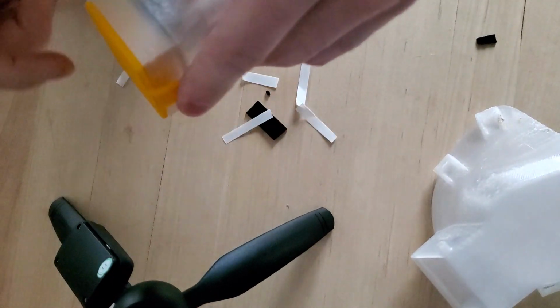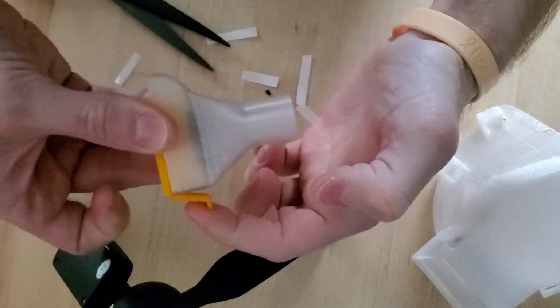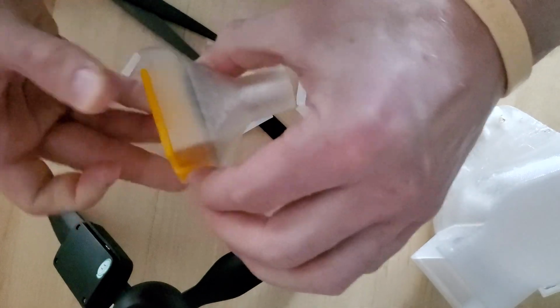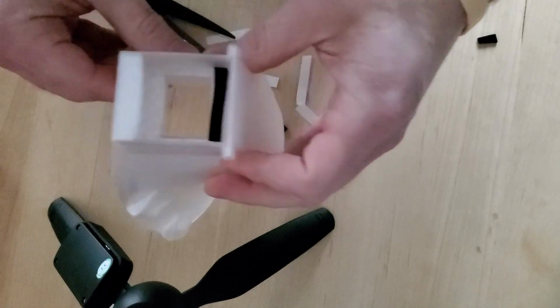And if you want extra security, you can take a rubber band and tightly tie it around here, and around here, and that'll just hold it down that much harder. Okay? So that's it for this. You do the same thing if you're using this style mask.